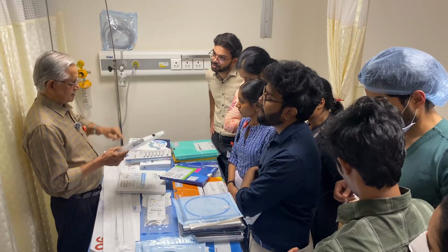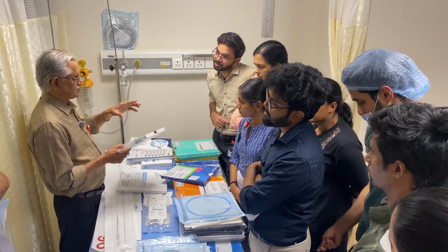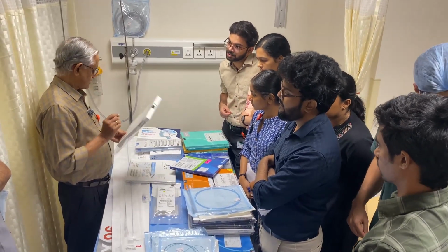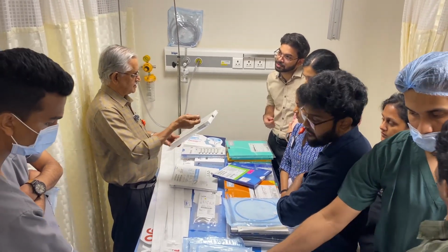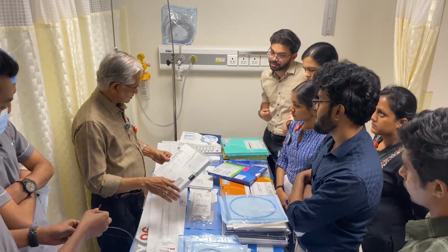You keep it there, and through that you pass a wire. Once it crosses, you extend the microcatheter beyond, take out the wire, and then put the retriever, and then take the thrombus out.